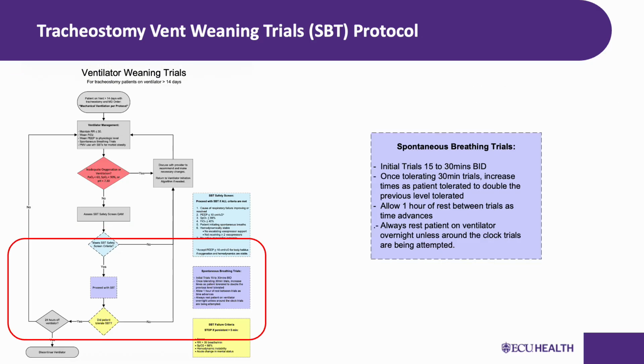Now here's where the progressive nature of the tracheostomy weaning protocol really comes to life. This slide shows you the trial progression schedule and its methodical, stepwise approach to building the patient's tolerance for independent breathing. Follow the flowchart carefully, assuming oxygenation and ventilation are not an issue, meaning the patient is stable on their current settings. Here's how the trials progress.